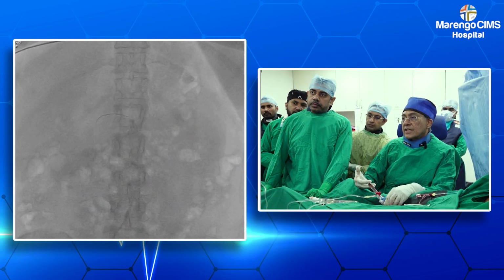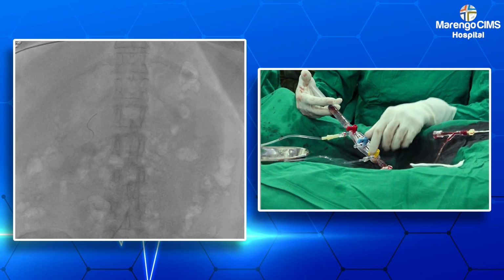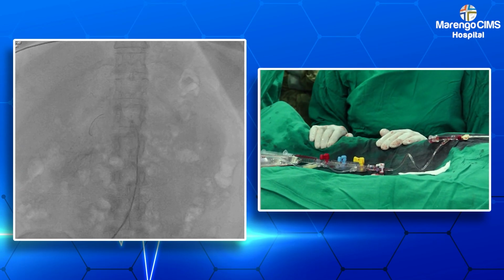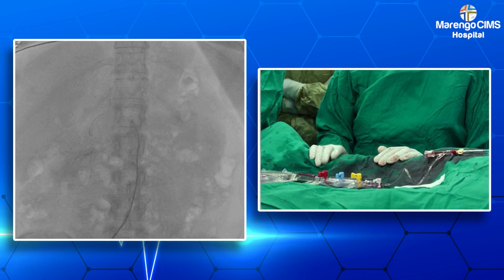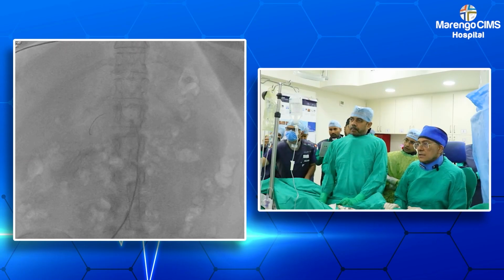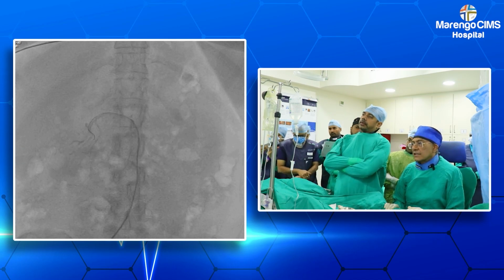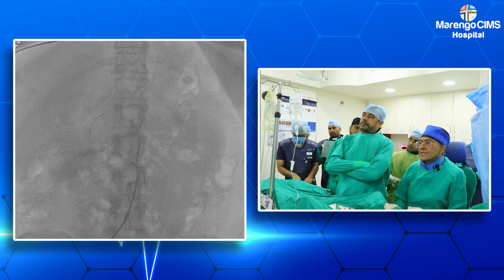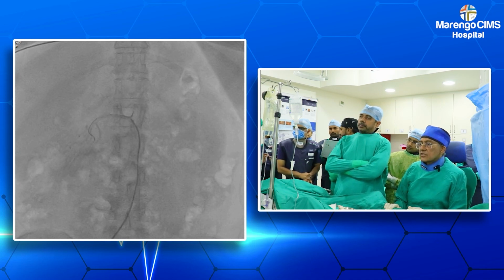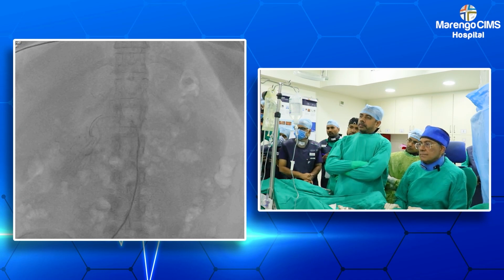So we have now cannulated the artery easily. We will take a short run with about 1.5 cc of contrast. Our baseline creatinine is 1.2. So we have a renal artery. The guide catheter is 6 French. So you can see the distalmost renal artery before the multiple distal branches is around 3 mm visually.